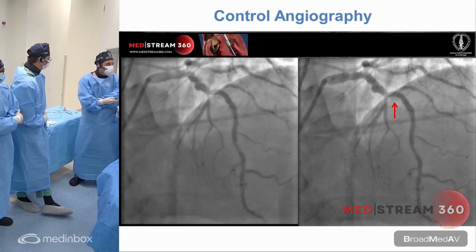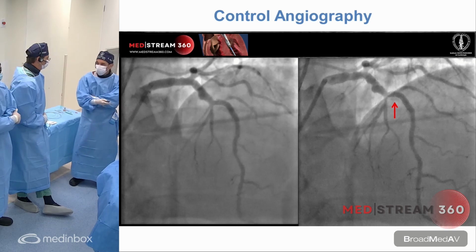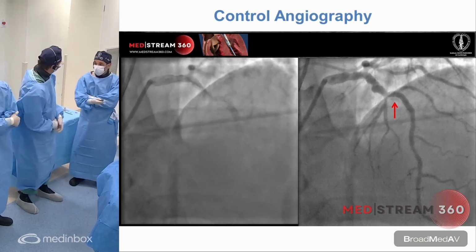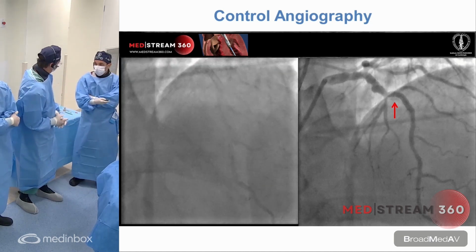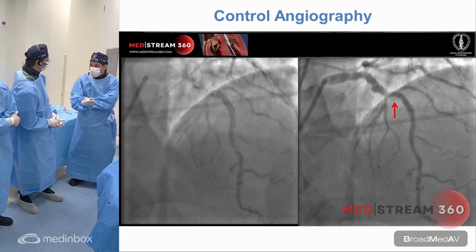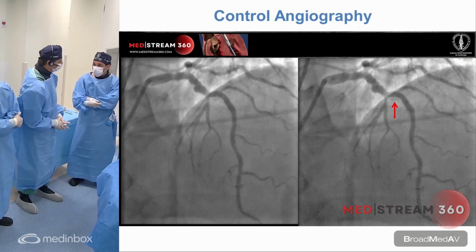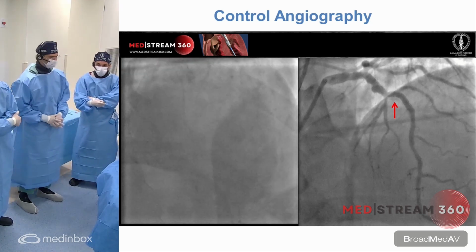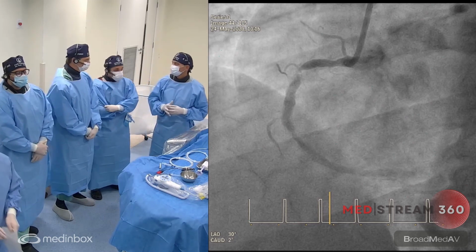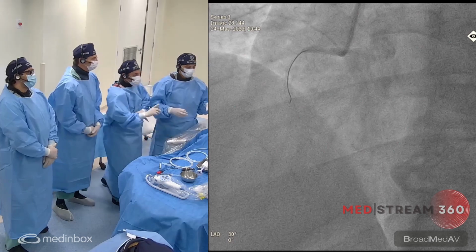When we saw the fluoroscopy, right, Rodolfo, you can see now it's very calcified. And we don't have, for example, devices like intravascular lithotripsy on the shelf. So nowadays we have to schedule those kinds of procedures. We decided to perform intravascular imaging first, before the pre-dilatation. We tried, right, Rodolfo? But we didn't succeed.